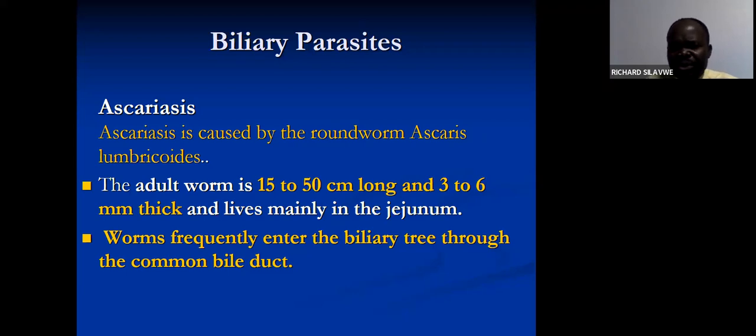You find that most of the patients that came for sonography, we could be able to detect the worms. We'll be able to see them physically, even sometimes moving right there in the common bile duct. But here in Namibia, I've not found any. Even in Zambia, I never saw a patient with the worms in the common bile duct, but they are actually there.